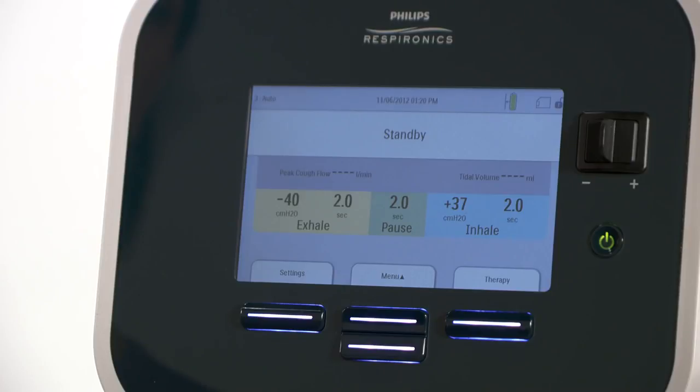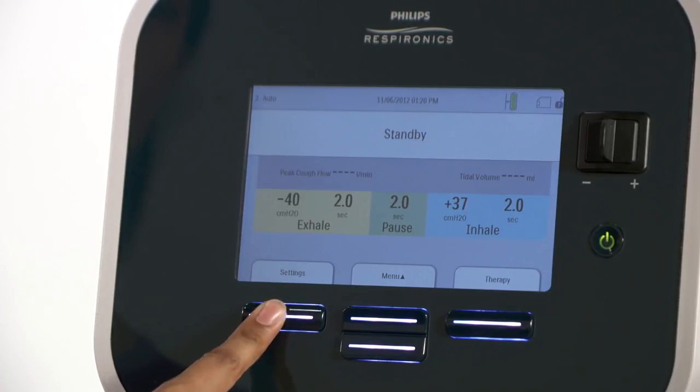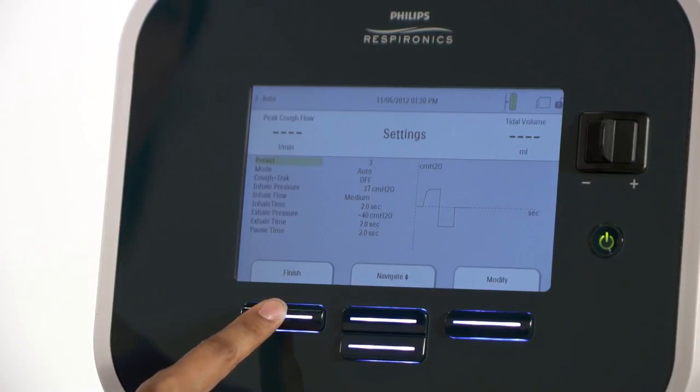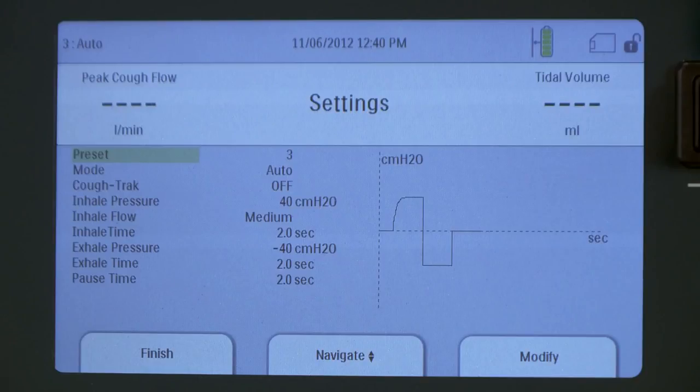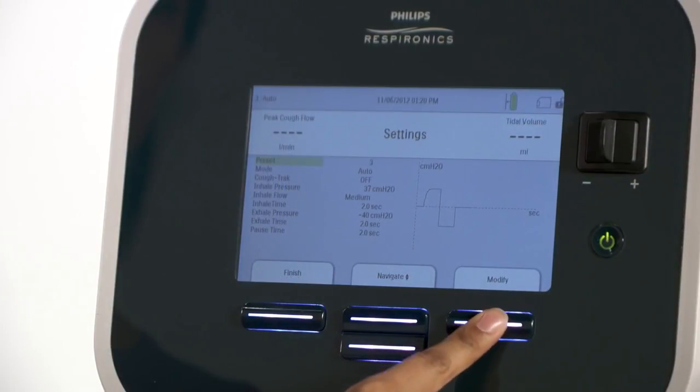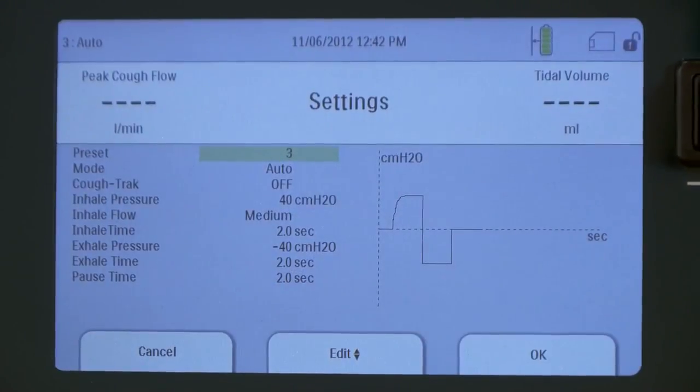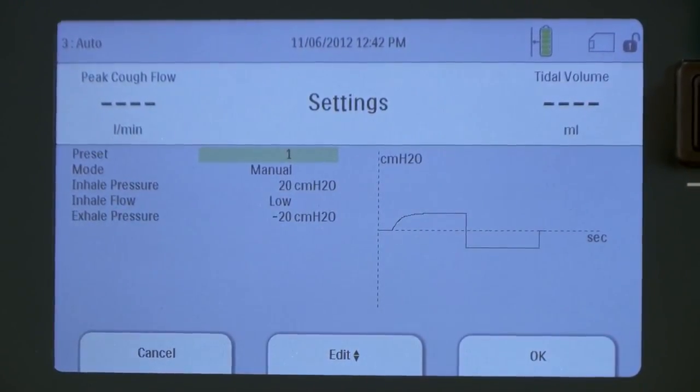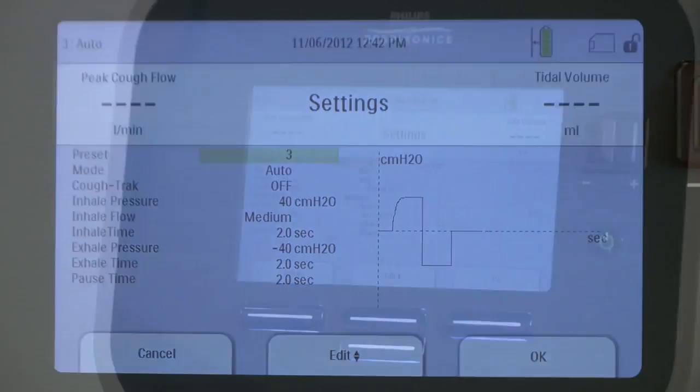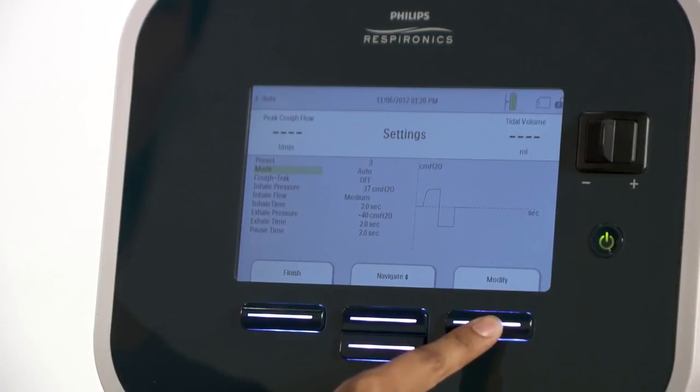To enter prescribed settings, press the left button under settings. A setting menu will appear. The first item on the list will be highlighted, in this case, preset. Press the modify button. You can select which one of the three presets you wish to modify. Press the OK button to confirm the preset.